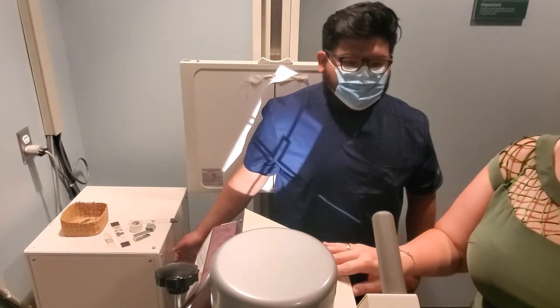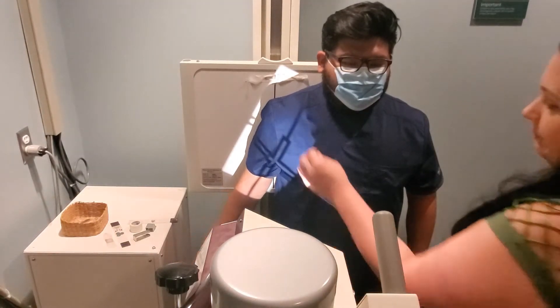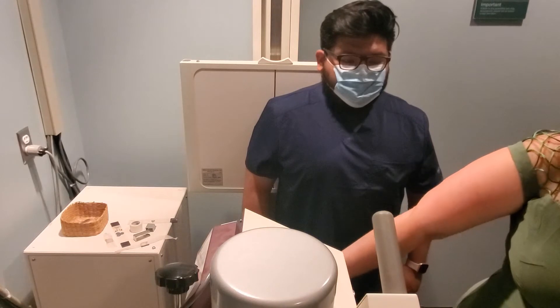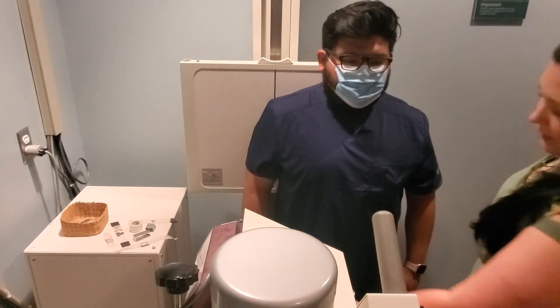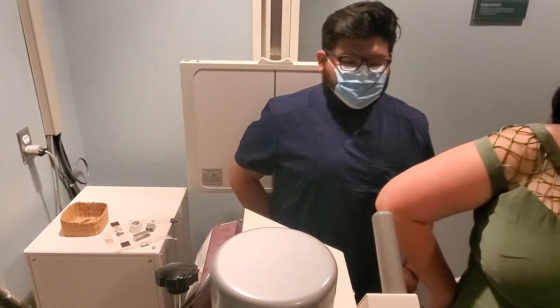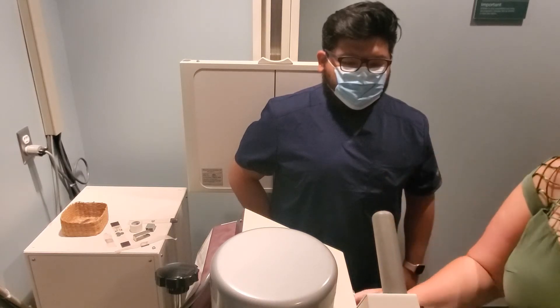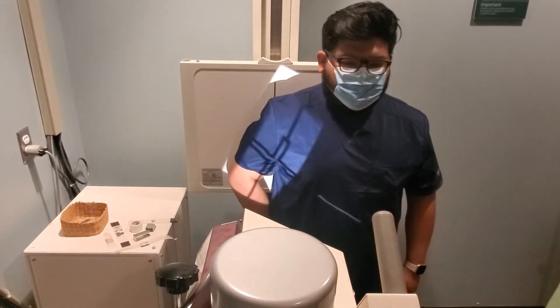From the AP position it's easy to transition to the lateral. Have the patient relax their arm, then turn their hand so the back of the hand is on their hip or thigh. This creates a little chicken wing position with the humerus and elbow. The arm will come up a little bit, which means your centering will need to change slightly.